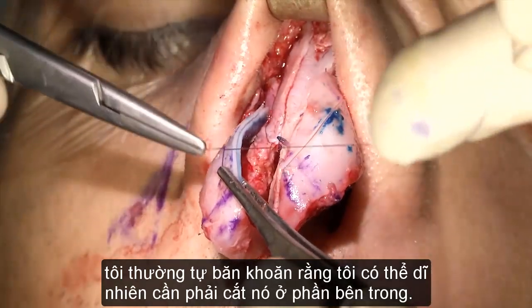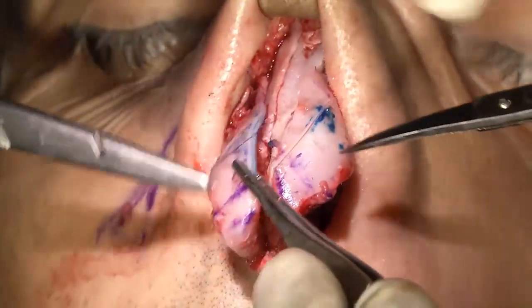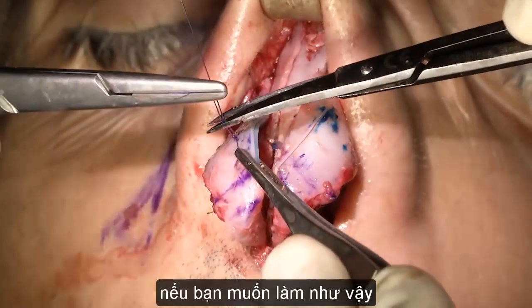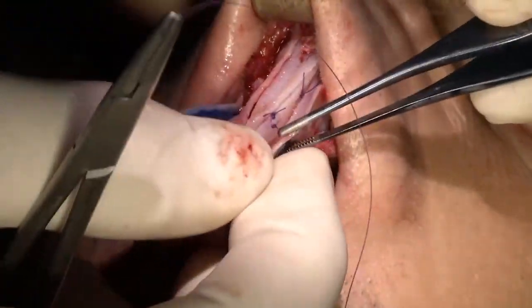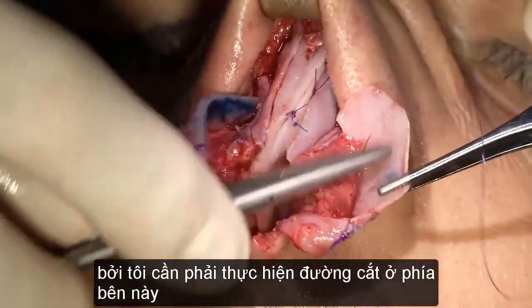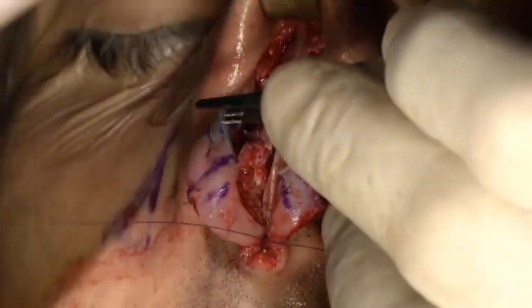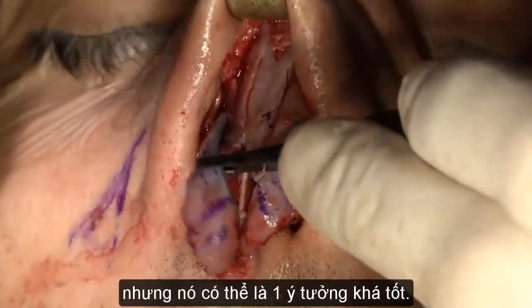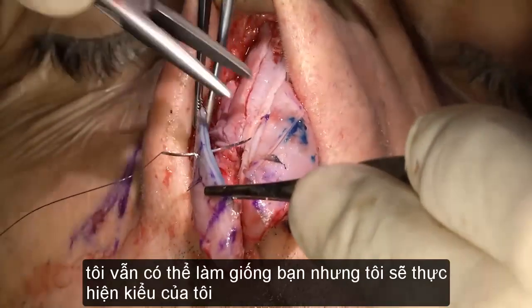I've kind of wondered this myself. You have to cut it on the inner portion, of course, if you want to do that, because now it would be a little bit late, because I would have to make my cut on this side. It could have been a good idea. I can still do it, but I will just carry on with this.